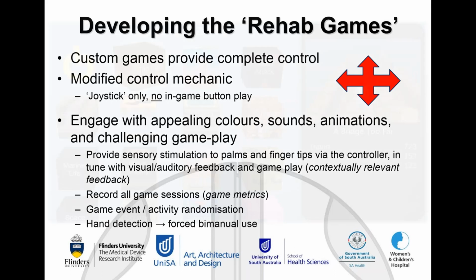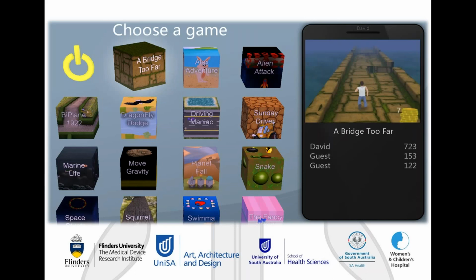So in terms of what the gaming system looked like, I'll just slowly introduce it to you before I show you a video of some of the games that we developed. So this is the main menu screen that you see as soon as you log in. So this is actually the second screen. The main screen is just the login screen.